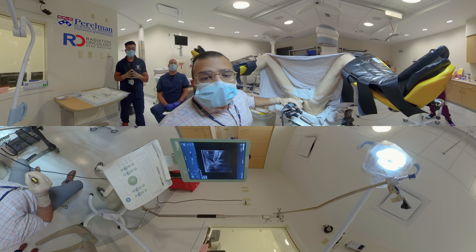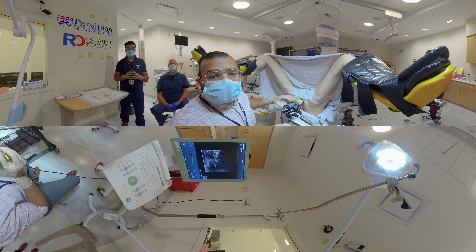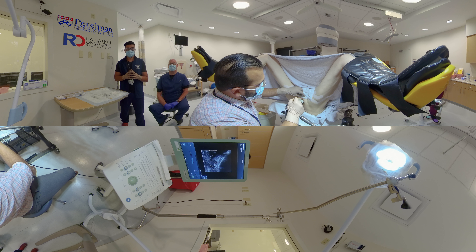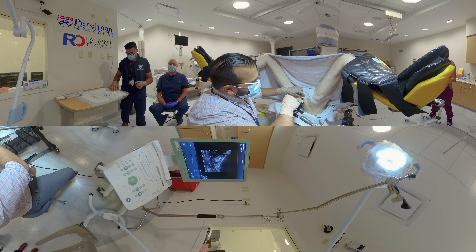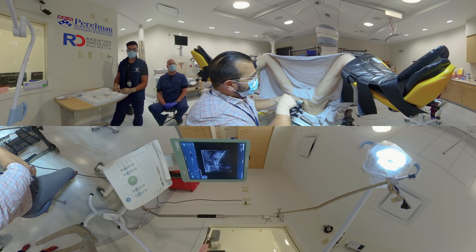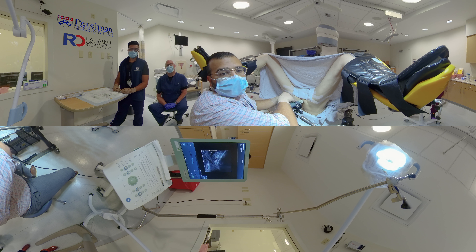Our standard positioning for prostate markers for IMRT, SBRT, or intact prostate proton radiotherapy is at the left mid-gland, right apex, and right base, or vice versa. First, I'll rock the ultrasound to the patient's right to be right of the midline, and we'll follow the line of the ultrasound into the prostate gland. It's important to follow the pathway of the ultrasound probe into the patient. I recommend inserting parallel to the probe length, following an imaginary line from the buttons down along the length of the ultrasound probe and into the patient. You can see the visualized needle entering the prostate gland.